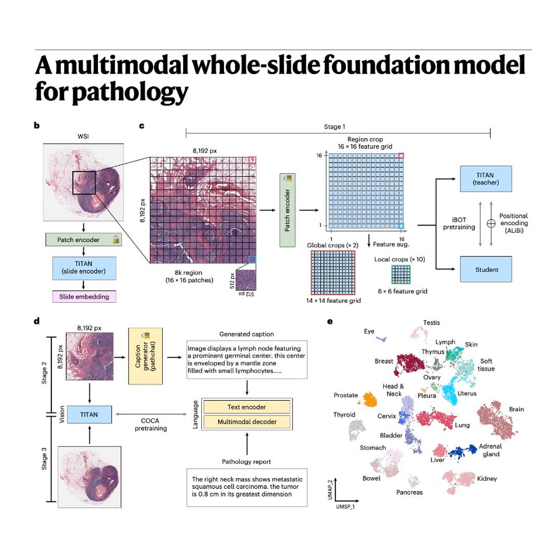This is where that map analogy really clicks for me. If the WSI is a high-res map of a city, and the features are the detailed tiles, stage one isn't just learning what buildings are in one tile. It's learning that if tile A shows a highway ramp and tile C shows a high-density apartment block, then tile B, the one that's missing, probably shows an access road connecting them. It's learning the logic of the map itself. Precisely.